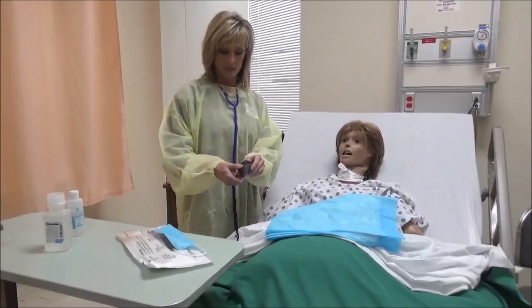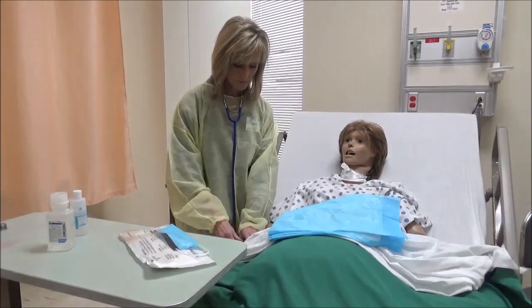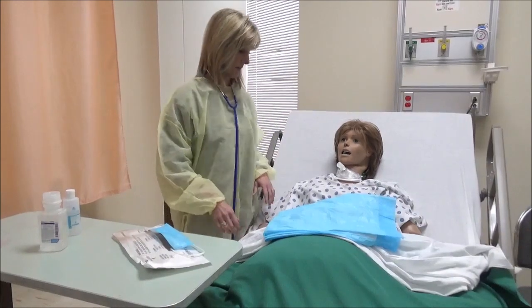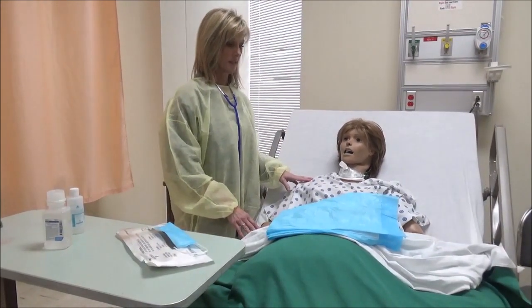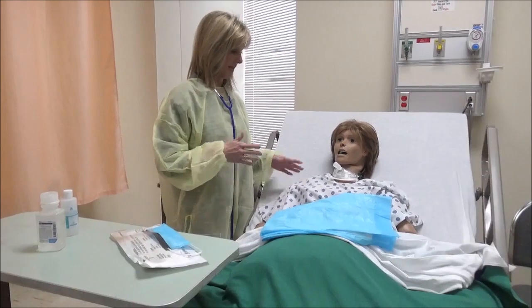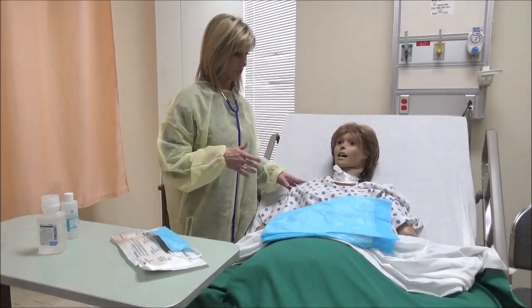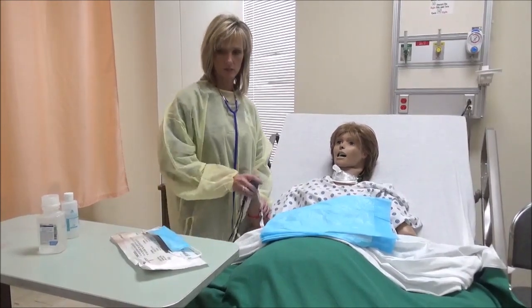So I have an O2 sat monitor. I'm going to put that onto my client's finger, and I'm also going to make sure I establish some sort of communication with my client so that if they experience any kind of discomfort or distress, they can communicate that to me. So Ms. Jones, if at any point during the procedure you have some kind of distress and you need to communicate with me, just make sure you raise your arm. And can you do that for me? So at this point, she would raise her arm.